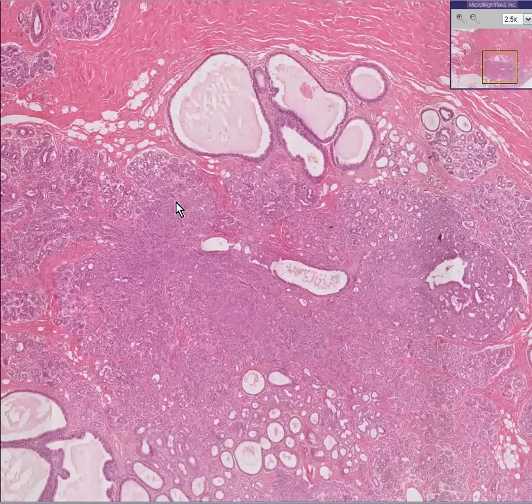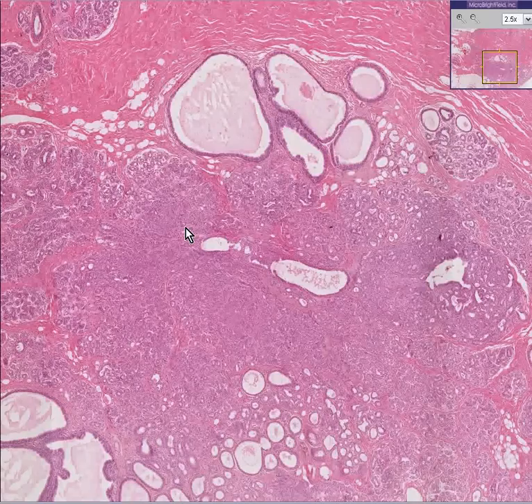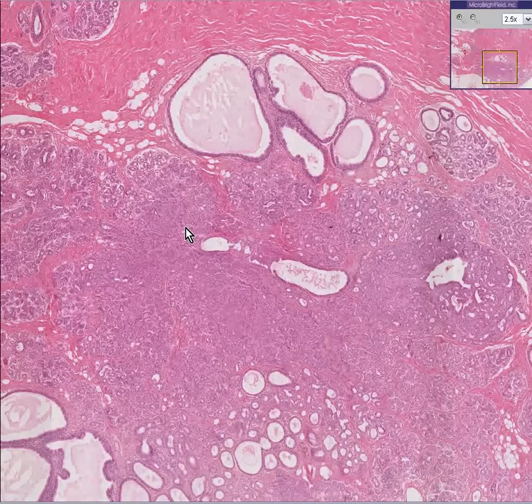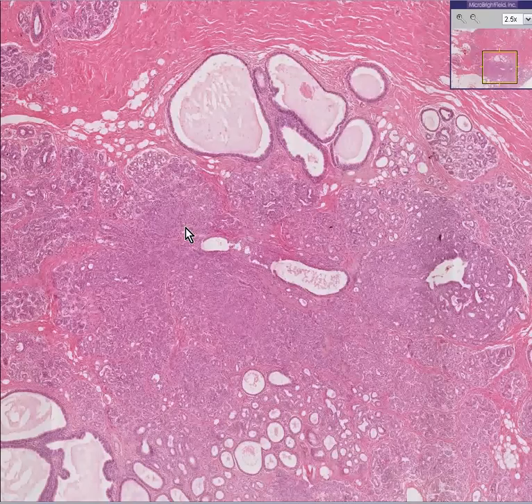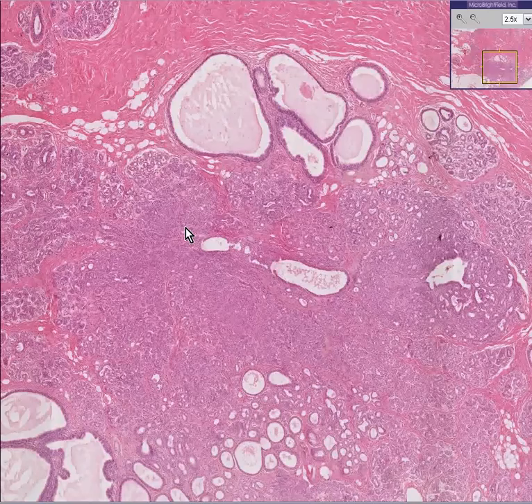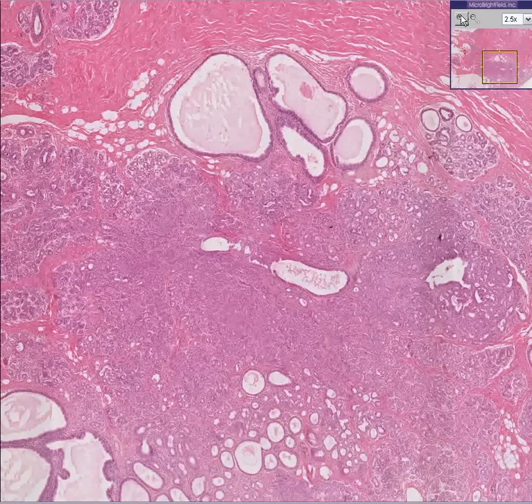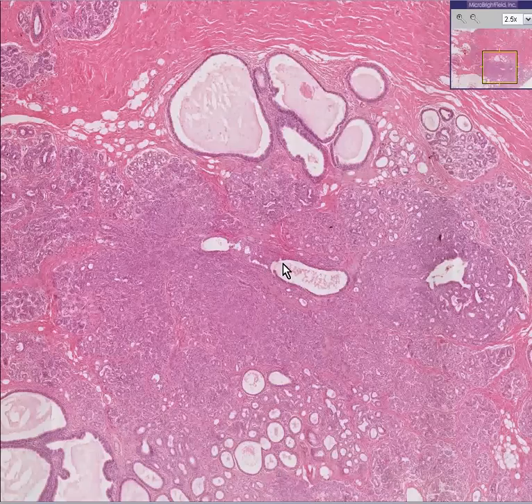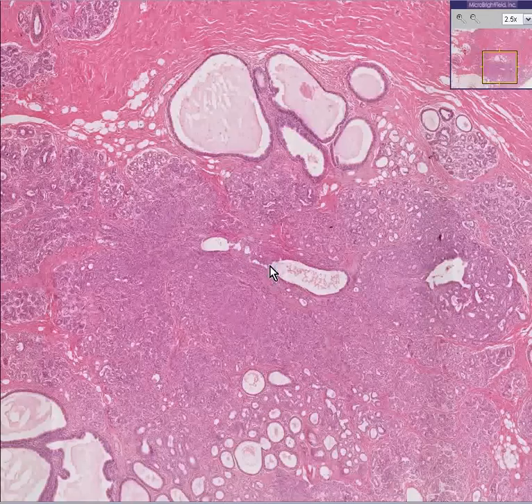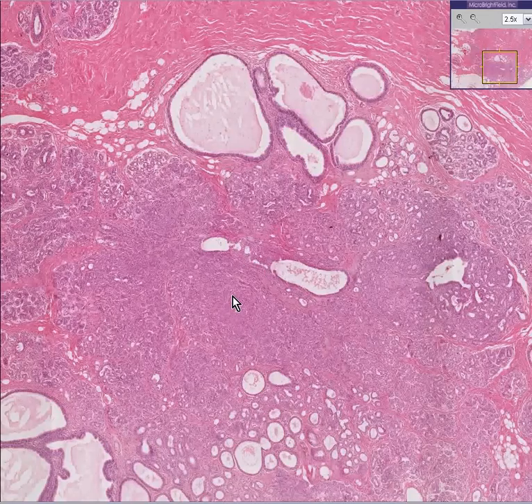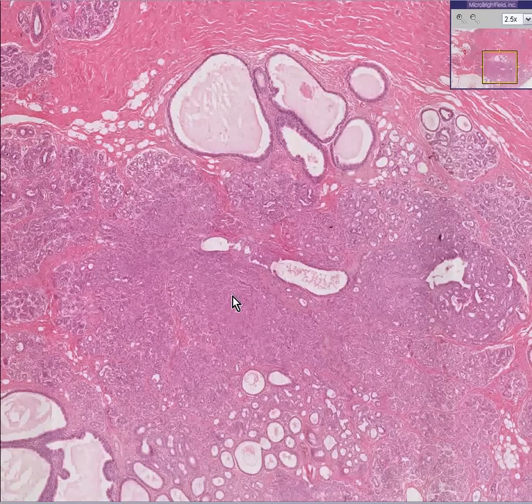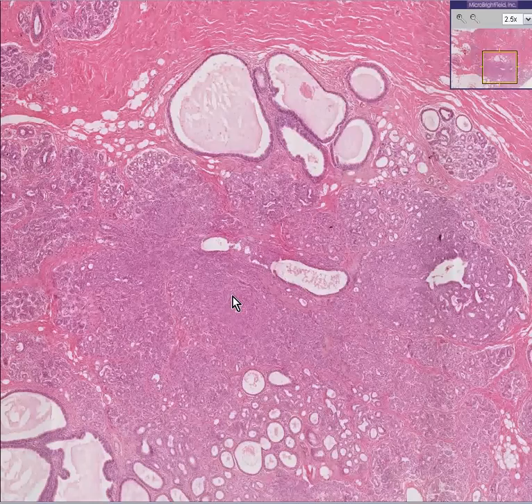Whenever you have fibrocystic disease with a component of epithelial proliferation, this goes into the category of fibrocystic disease that is higher risk than the fibrocystic disease with no epithelial hyperplasia. The good fibrocystic disease wouldn't have any hyperplasia — just simple little cysts. The worrisome type has hyperplastic ducts and lobules, and although this is not at all guaranteed to progress to cancer, it is statistically associated with a higher risk for subsequent malignancy.